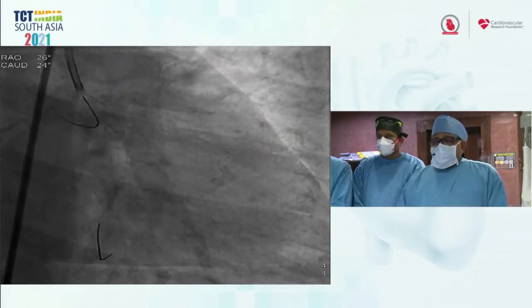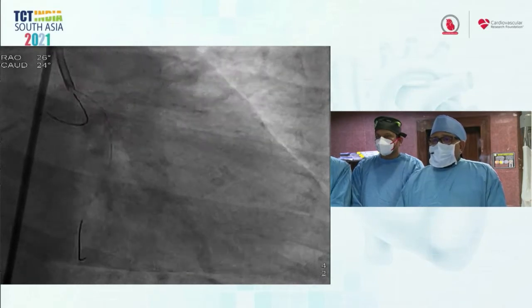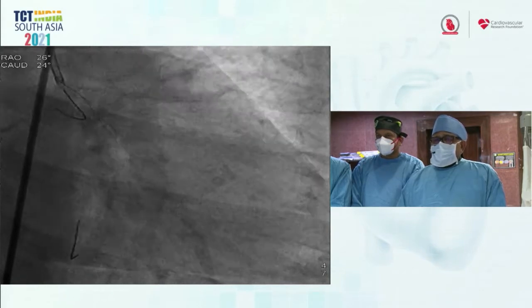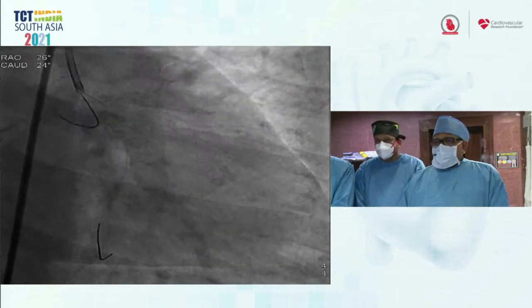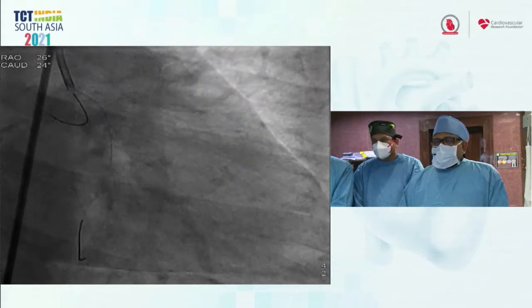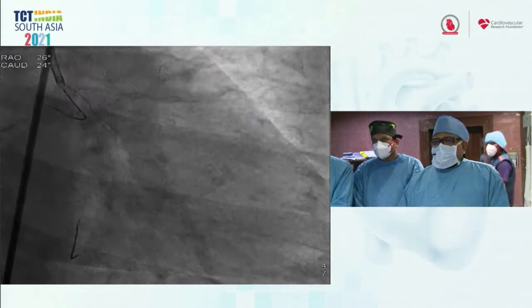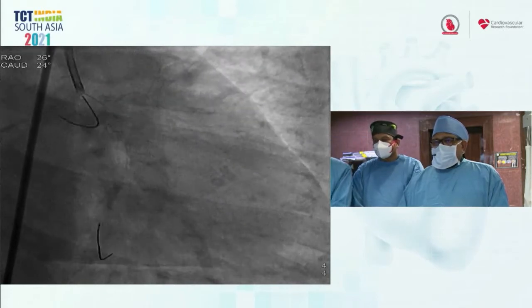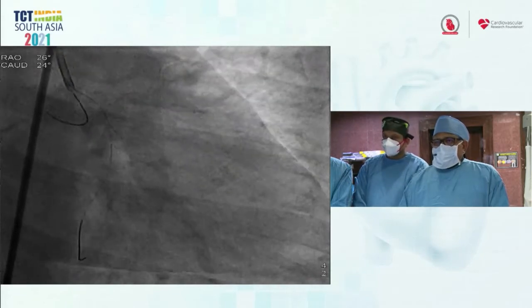So, opinion of the chairperson, how should we proceed further? We can't hear you. I would pass it on to the panelists, and I think it's Dr. Mahesh who's there. Sir, I would like to image the circumflex ostium, confirm that it's actually disease-free and it is safe to go in for the one-stent strategy. Then I would like to image the LAD to see how bad or how good the lesions are going to be, and then decide on plaque modification depending on these two findings.